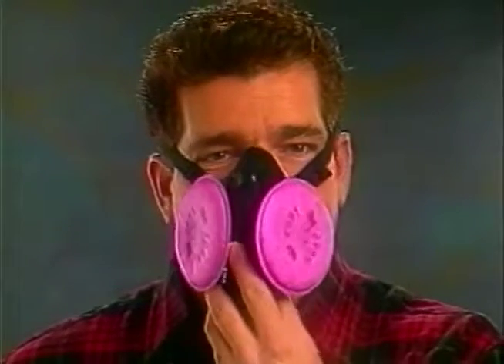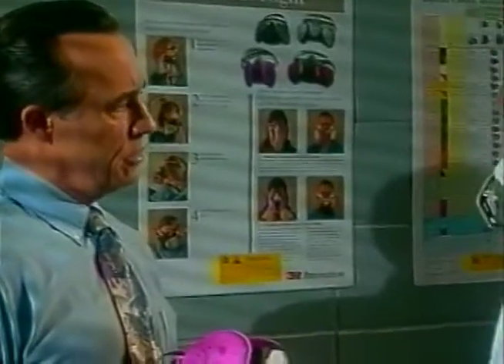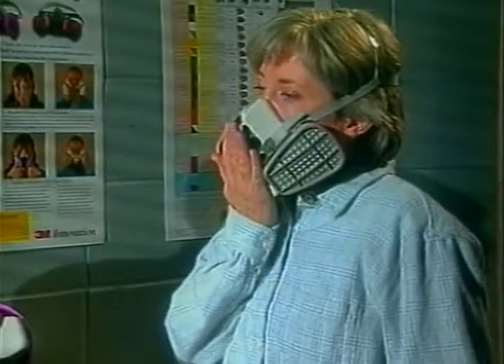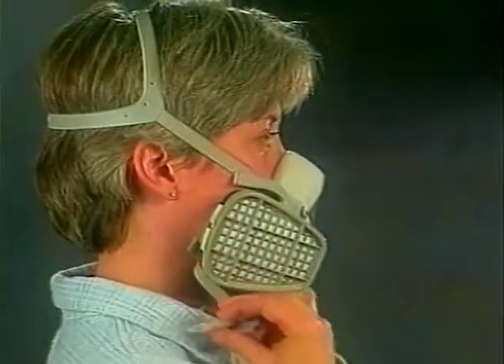If you detect a leak while carrying out the positive or the negative check, reposition the respirator on your face and readjust the strap's tension. Repeat the test. If you can't get a proper seal, consult with your supervisor. A different respirator may be required. To remove the respirator, undo the lower straps first, and then remove the head harness.